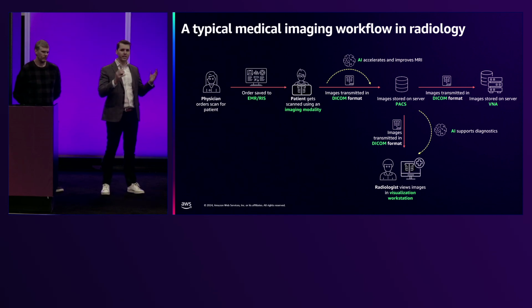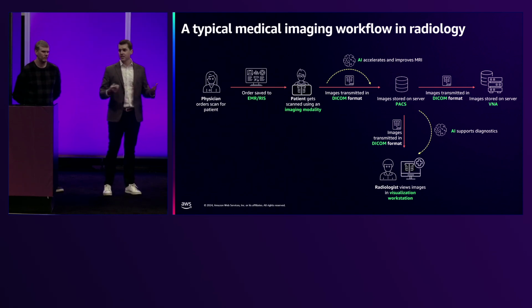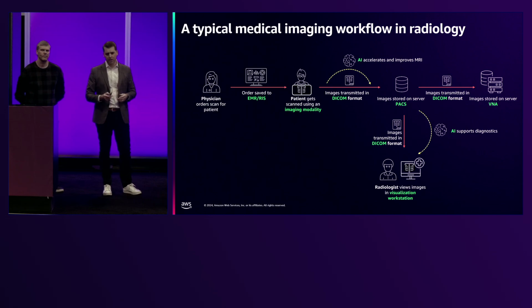And they're not only looking at the image, but they also need more context, right? They're pulling in information from the electronic medical record platform, maybe patient labs, looking at their comorbidities and other challenges that they may have from a health perspective. And that's a really difficult challenge for radiologists when you're thinking about all these different data inputs while evaluating all these different images. It presents a challenge.